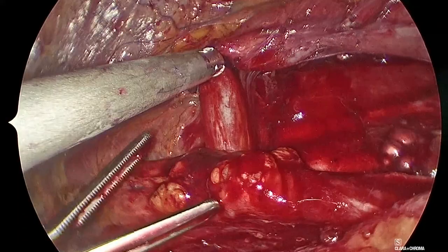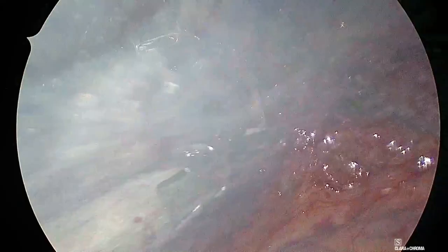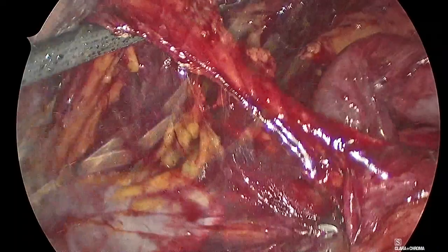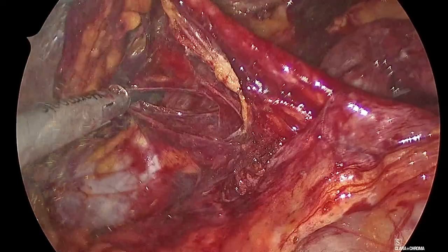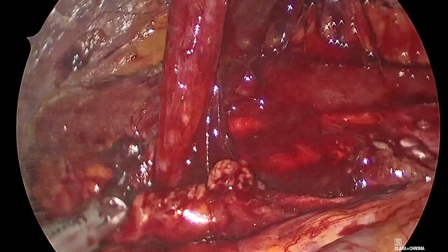I think we have to clip the gonadal because there's a little bit of a bleeder in here. Let me see. Okay, let's see. Good, good.